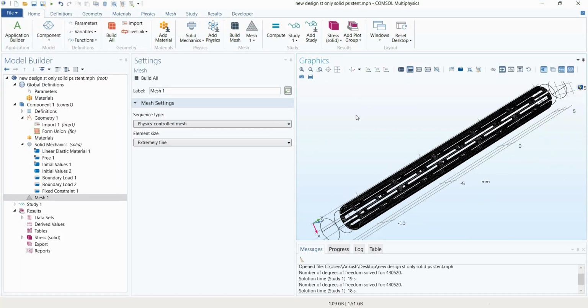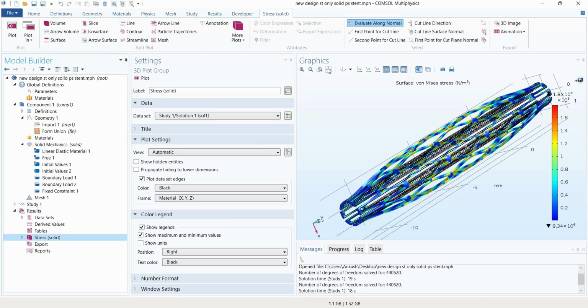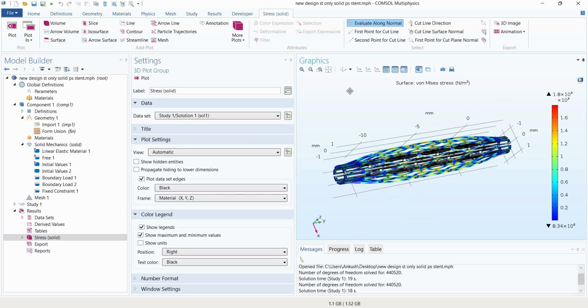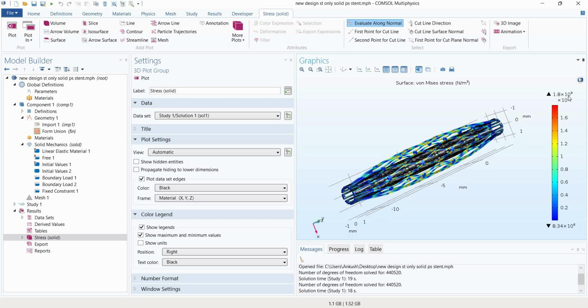Then we clicked compute in the study section and got the von Mises stress, as you can see here. This is for 14 atm inner load. The maximum value is 1.8 into 10 to the power 9.